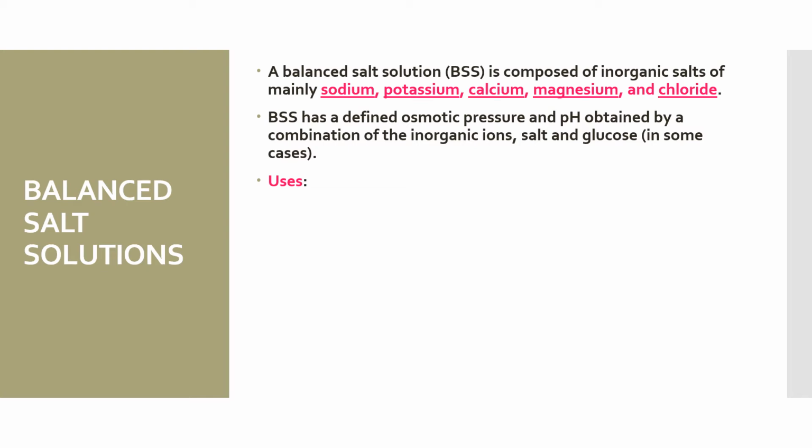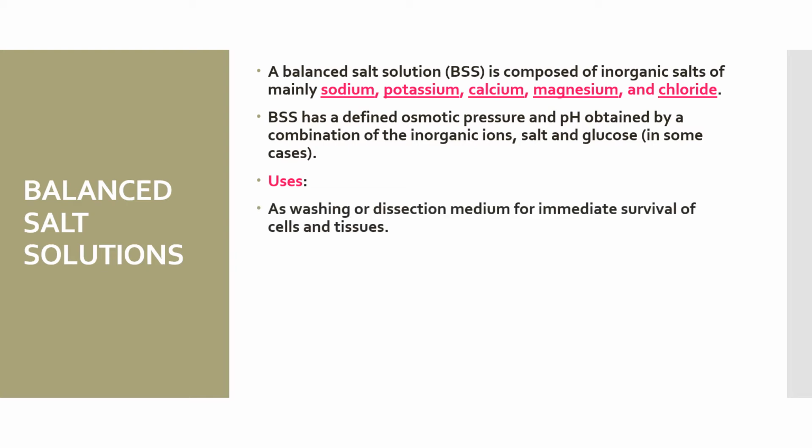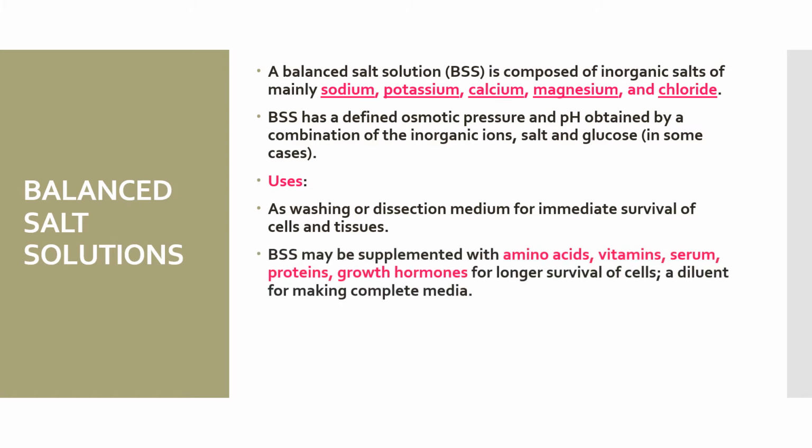Balanced salt solution may be used as a washing or a dissection medium for immediate survival of cells and tissue explants. Also, balanced salt solution may be supplemented with amino acids, vitamins, serum, proteins, growth hormones for longer survival of cells, so it's used as a diluent for making complete media.